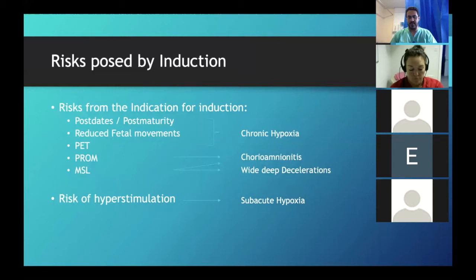So she may be contracting 1 to 2 in 10. Yesterday, we had a lady in theater that was contracting about 2 in 10, but each contraction was lasting about 2.5 minutes. Baby was fine with that, but obviously some babies would not be. 2.5 minutes is a little bit too long for some babies. Does that make sense?